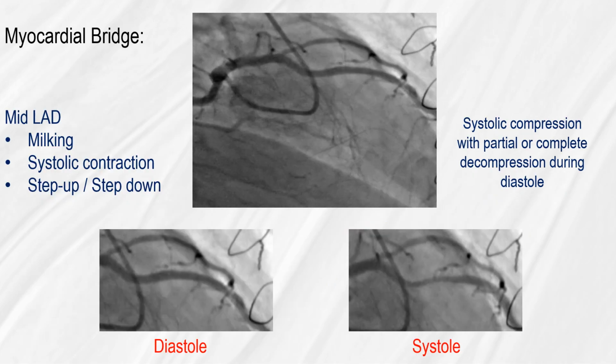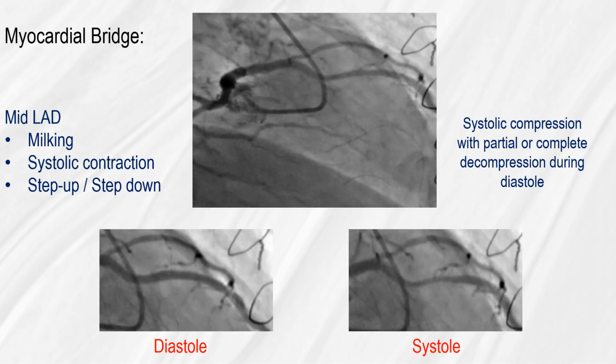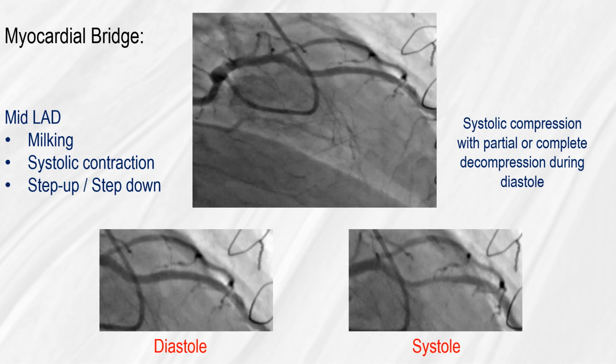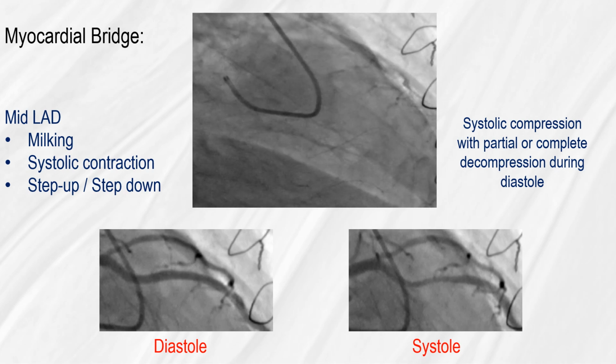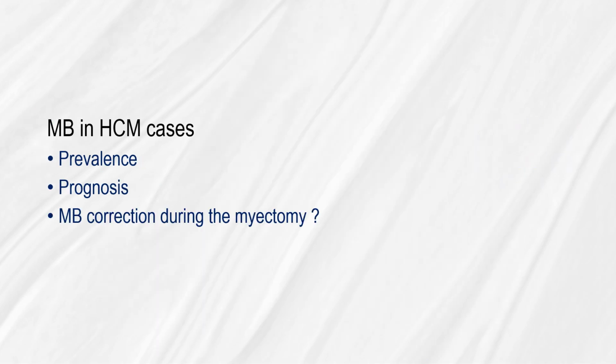As we can see in myocardial bridge with intramyocardial course, there is mid-LAD milking due to systolic compression with partial or complete decompression during diastole. We will discuss myocardial bridge in HOCM cases regarding prevalence, prognosis, and myocardial bridge correction during myectomy.